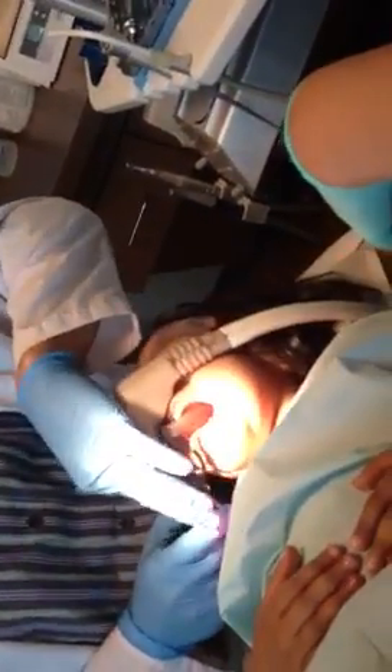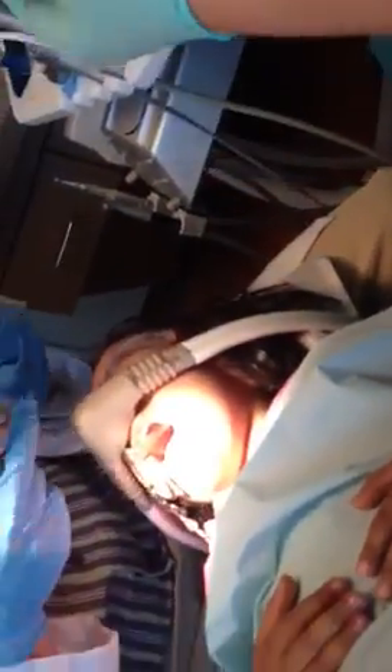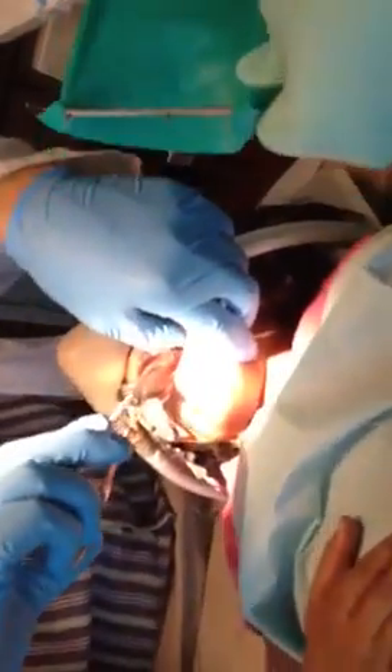We've got this cool ring for your tooth — it's kind of like jewelry. Check it out. See how it goes around my finger like this? It goes around your tooth the same way. When I put it on, you'll feel like a hug on your tooth. So it's kind of like trying on shoes — let's see if we can pick the right size here.